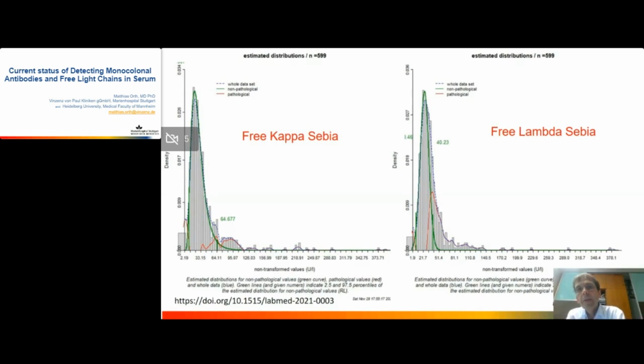And this is also logical because the reference ranges are found in young patients with normal renal function, and our testing was performed in older patients, most of them with impaired renal function. And so we employed an indirect method. Essentially this indirect method uses patient data and tries to differentiate patients with normal values from patients with abnormal values.